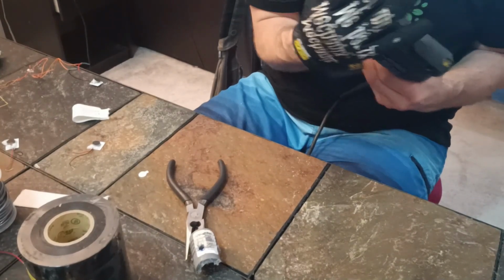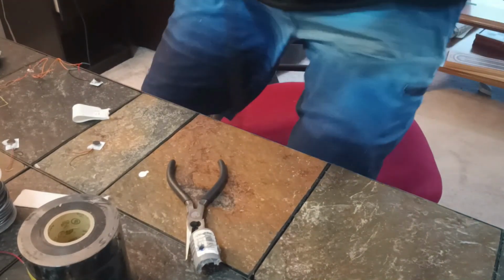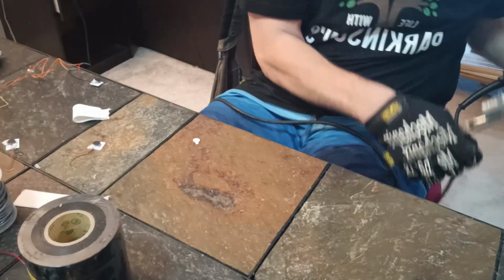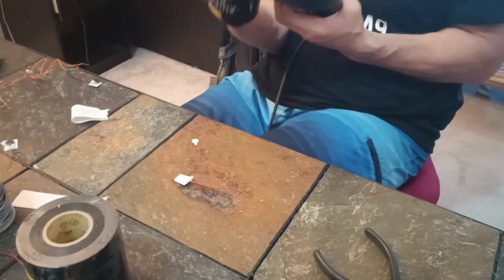Okay, next side. Okay, done with the drill.